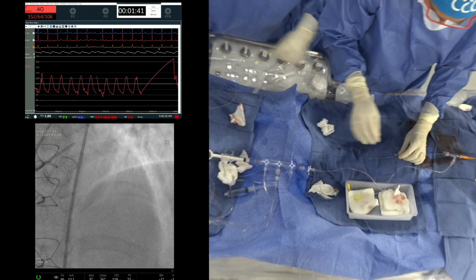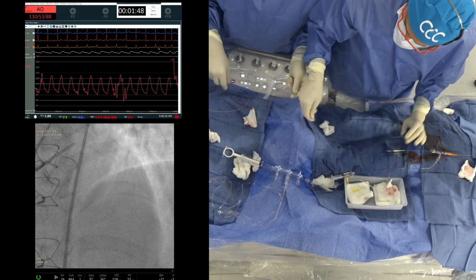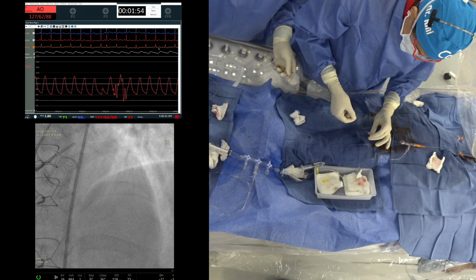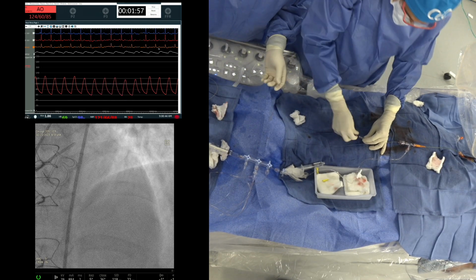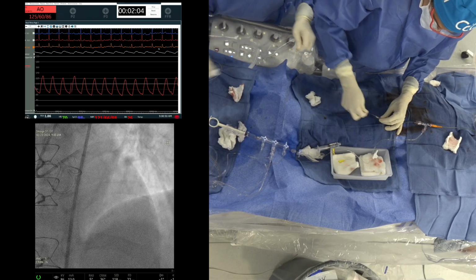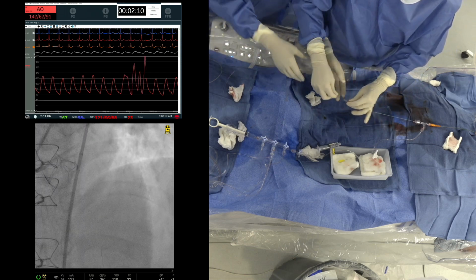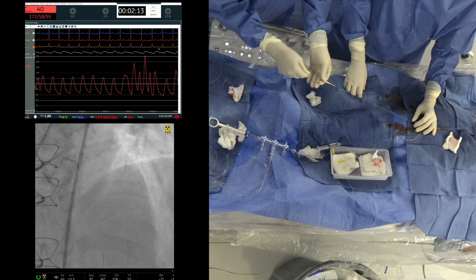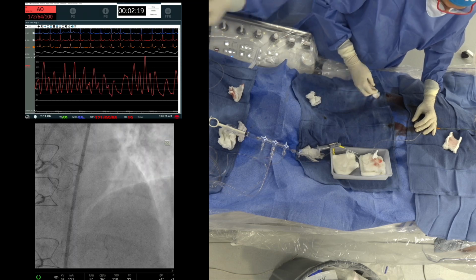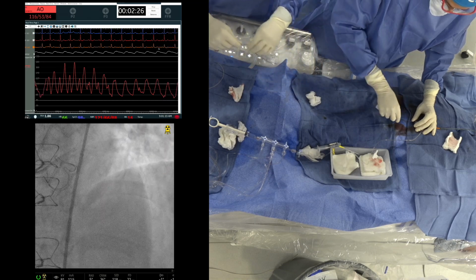The key is, I still believe the OPN is just going to expand it. In this calcific nodule, you need a little more cut in the nodule, the crack, which we call cracking or shaving. So combine both. Yes, OPN NC is reasonable too, but we need to expand that further. We actually have not started using OPN NC here, though it's been available for almost a year. One simple reason is cost: it's an added cost with no separate reimbursement. It is about $1,200. They brought it down to $1,000, and the cutting balloon is $650. So we said, till they become $650, why should we use any adjunct balloon, which is going to cost us the most.